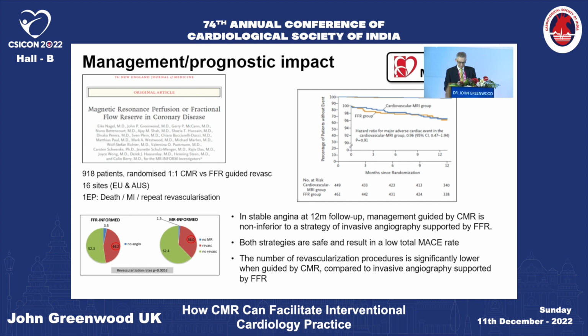And what you can see here, first of all, in the MACE curves, is that there was absolutely no difference between those two strategies. So at 12 months follow-up, management by CMR was non-inferior to invasive coronary angiography supported by FFR. Both of the strategies were very safe, and we know that in stable coronary disease anyway, it's a relatively low-risk group. But importantly, much fewer coronary angiograms were being performed and much fewer revascularizations were being performed, but no MACE penalty at all.